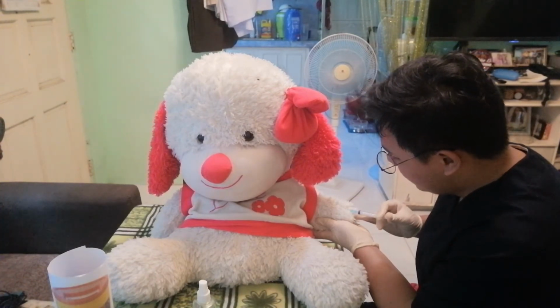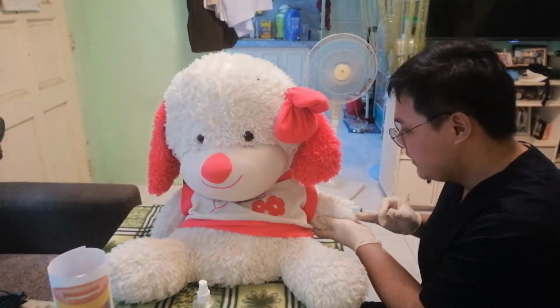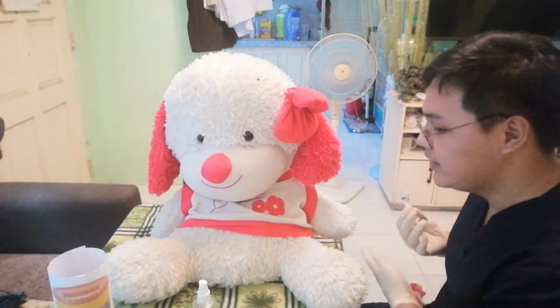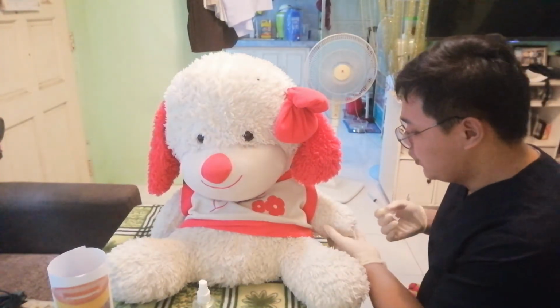After that, we need to remove or withdraw the needle and the syringe quickly at the same angle at which we inserted the needle. And after that, we need to make sure not to massage the area that we have injected because it will flatten the wheal that we have created. So upon the insertion and administration of the medication, a wheal or a bleb will be produced.